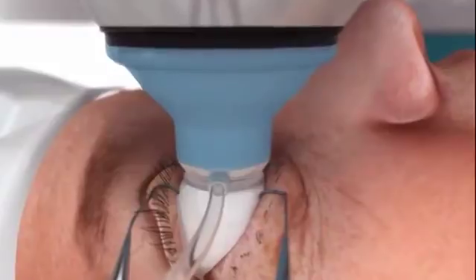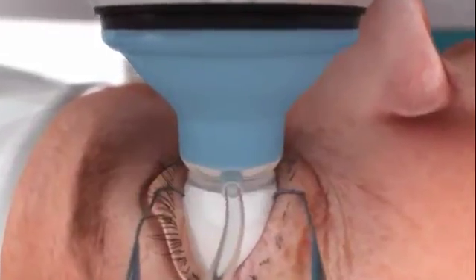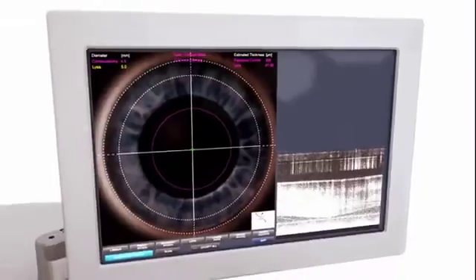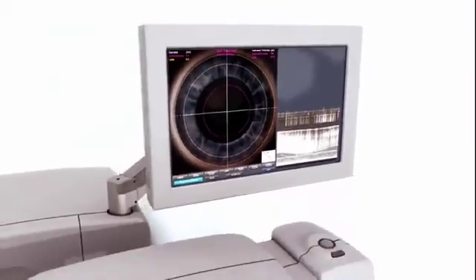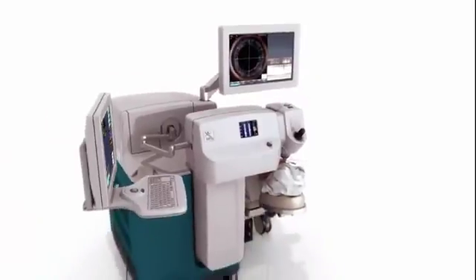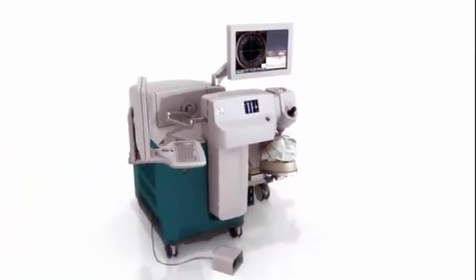The large-range OCT rapidly scans the entire anterior segment. This allows each step of the procedure to be easily planned, customized, and executed. Scans of anterior and posterior capsules are efficiently captured, then presented as unrolled real-time images for precise programming.